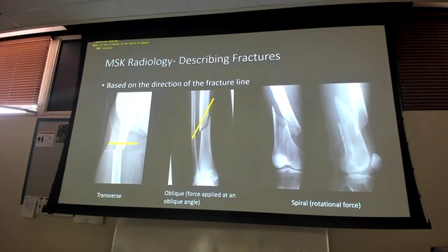Now the CT, because you have the different modes and the slices, you can do that. But from an X-ray, think of an old Polaroid camera. That's what this is. You got your Polaroid, and that's all you got. You can save it and look at it later, but you have to get the patient to do different positionings in order to give it to them.